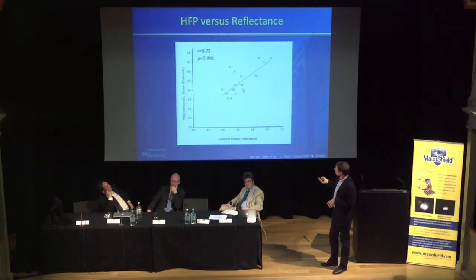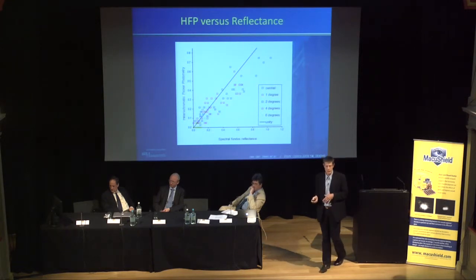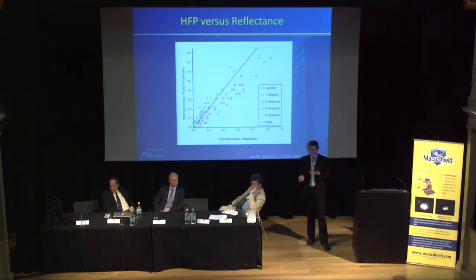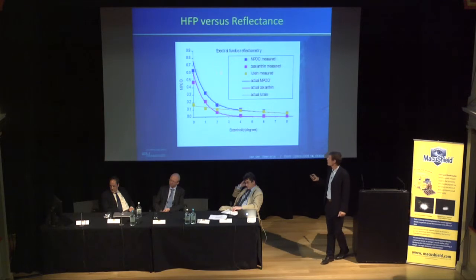In this particular experiment, we also measured different eccentricities, and then you see that there's a deviation if you go to the black squares, which is the central measurements, whereas it's more alike at the more peripheral sites. And we try to come up with a model to explain this, so to really understand what's the cause of this. So now it gets a little bit more complicated, and I hope I can get you through.